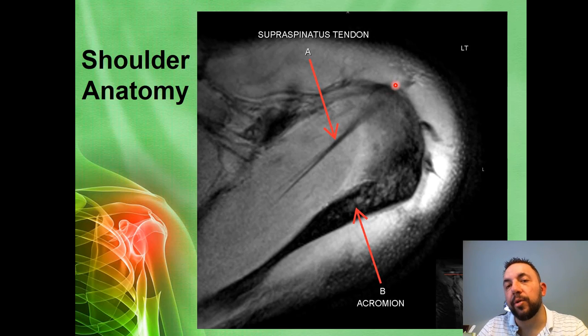Which gradients are utilized for our coronal oblique planning? That would be a dual combination of which gradient combination? The YX. Primarily Y because it's a coronal, but it's leaning towards the sagittal plane. So we utilize two simultaneous gradients to perform the function of the slice select process. In this case here, it would be the YX gradient application.